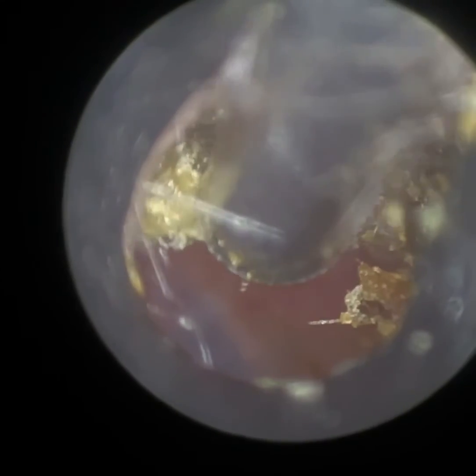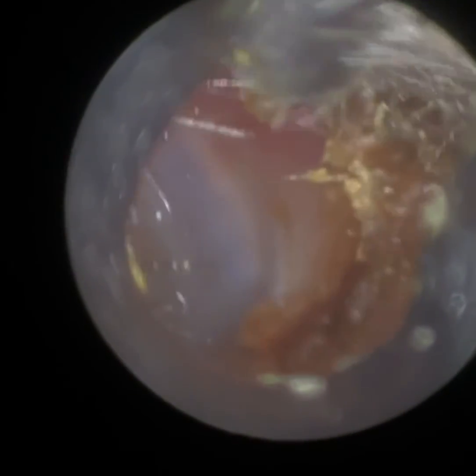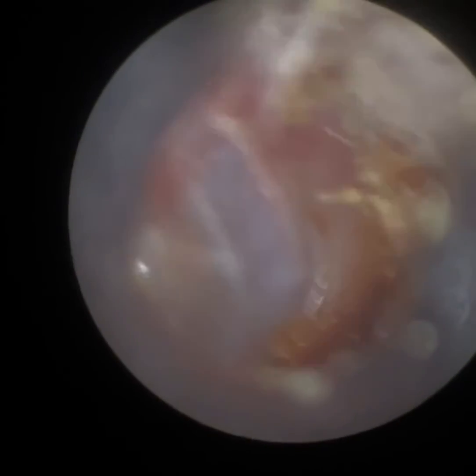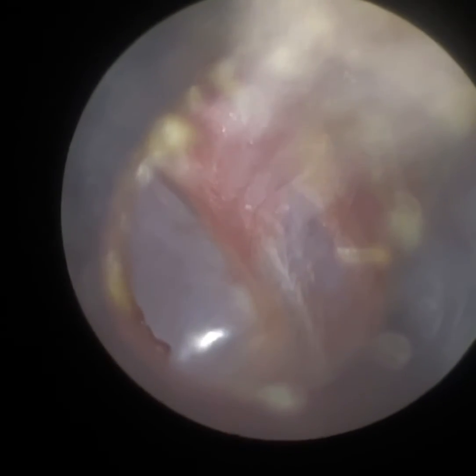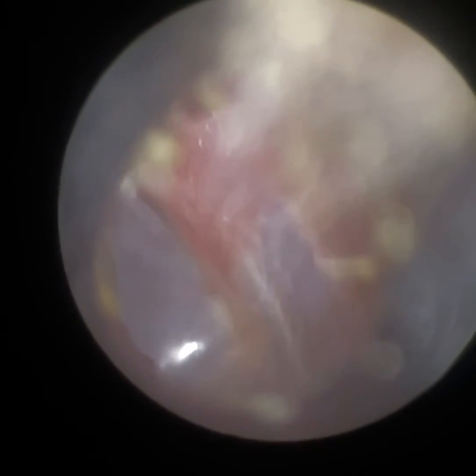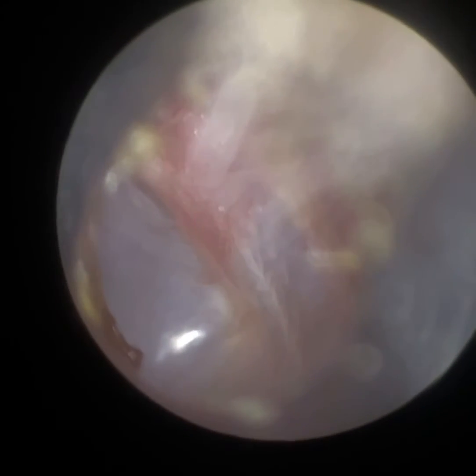Probably at the osteocartilaginous junction here — about a centimeter, centimeter and a half into the ear canal — just where the cartilaginous portion and the bony part adjoin. I can see the eardrum now. There's some wax posteriorly, but I decided to leave that. Got a good view of the eardrum there. Again, it's intact.